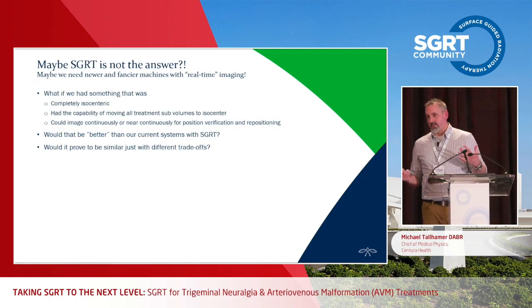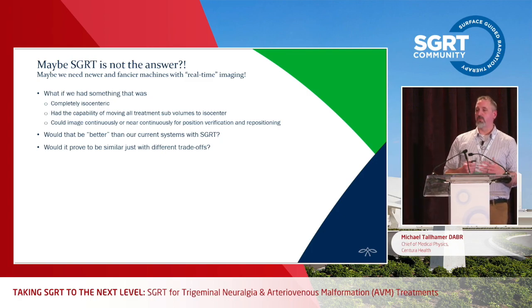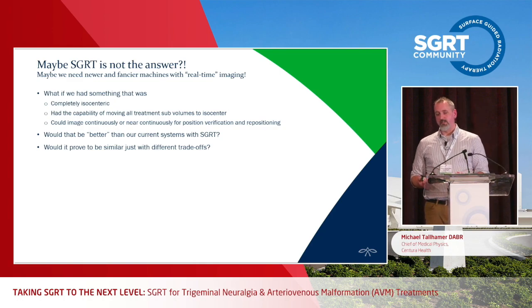That seems like a lot of things to do for a lot of busy people in clinics. You probably don't want to do that. But if you wanted to do it, SGRT gives you all of the information you need at the tolerances you want to set if you're willing to put in the work. But maybe SGRT isn't the answer. That's where Norman usually falls over somewhere. No, there he is.